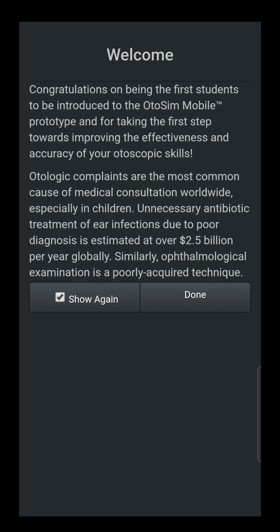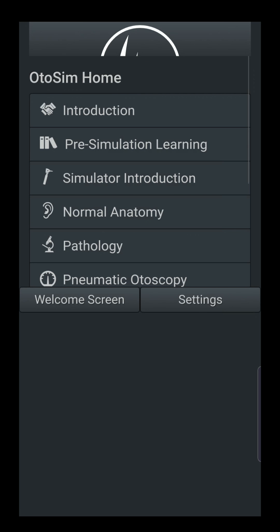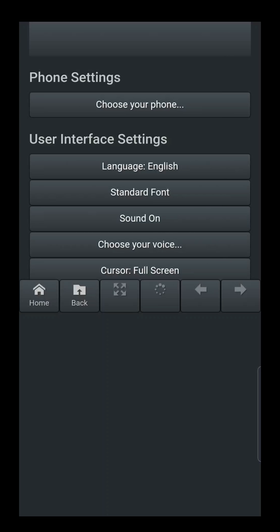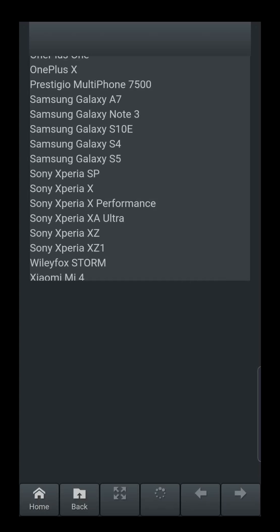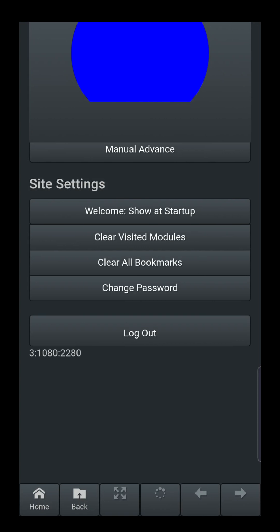The first thing we have to do is set up the resolution of your phone to match the program that we are accessing via the cloud. We go to settings and select our phone — in this case, the Samsung Galaxy S10e. You will see a blue footprint that shows up on the top of the screen. If you are not able to match that resolution, record the numbers on the bottom left of the screen. In this case it's 3:1080:2280 — that's the resolution of your screen. Email those to us and we would make sure your phone is set up in our database for proper magnification and viewing.